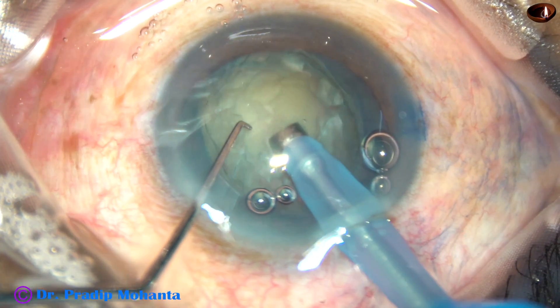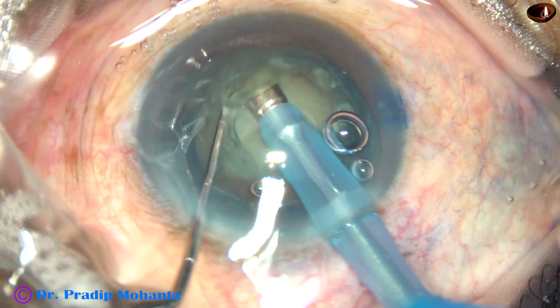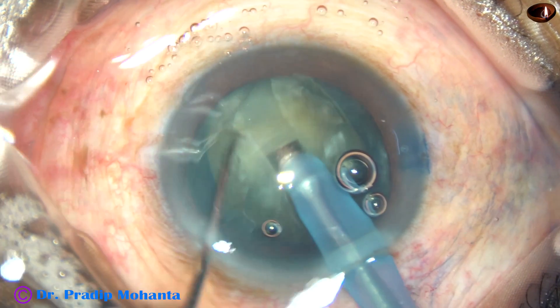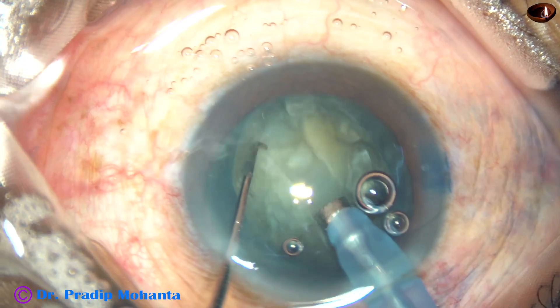At this time the vacuum is very low. In this case I have used only 60 mmHg vacuum. Flow rate is 22 ml per minute, and ultrasonic energy is 60%.